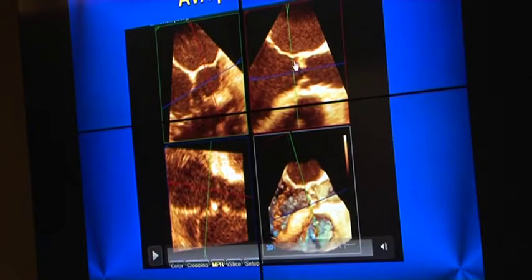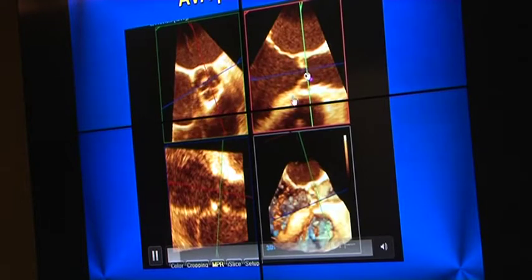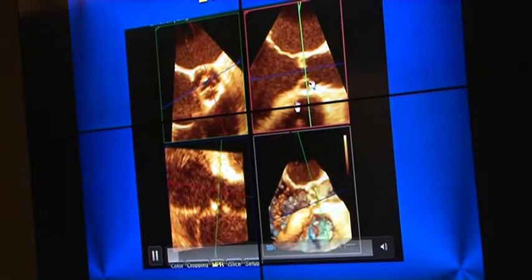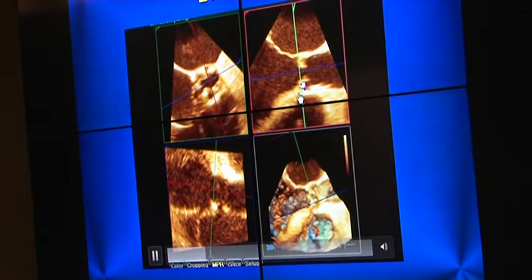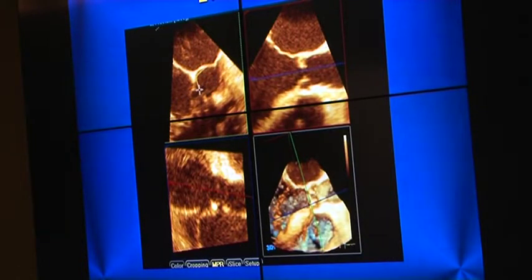And in case we are interested in the LVOT, we stop just here, go deeper, and measure the LVOT. Here you are. Okay, so now you just go further. This is a simple method. Before TAVI, we use the double oblique technique, which is more complex and resembles the CT method, but I don't want to scare you with complex methods right now.